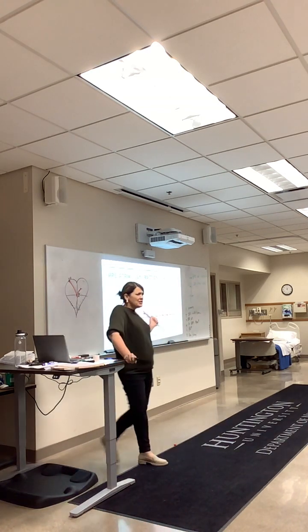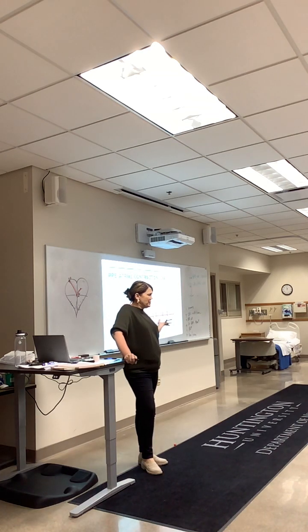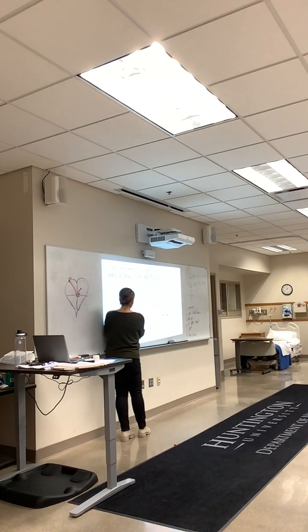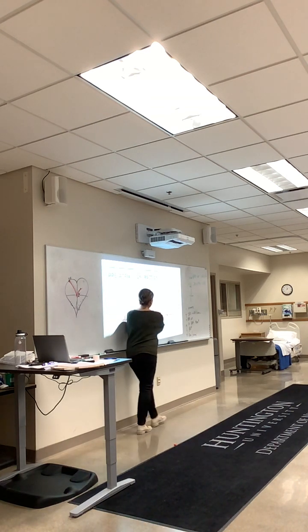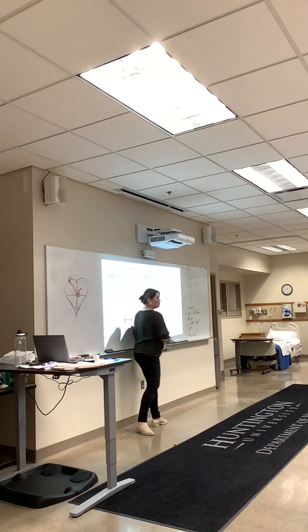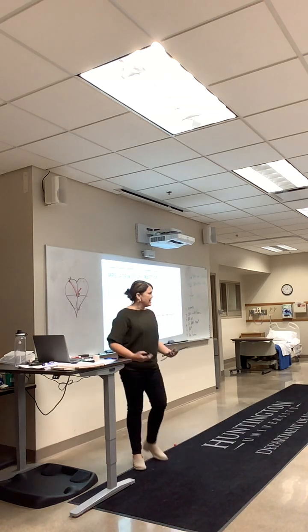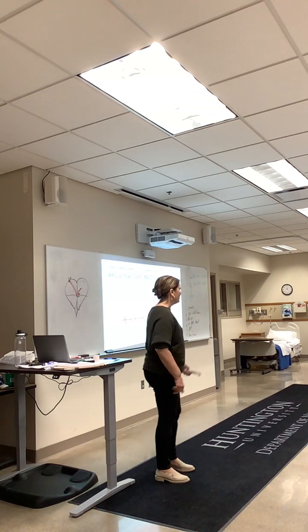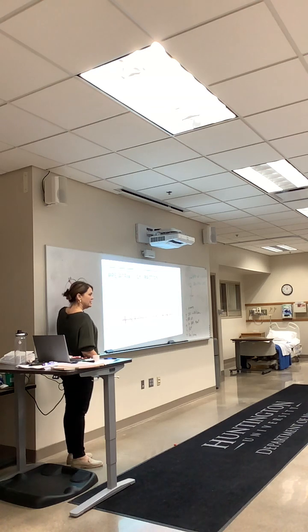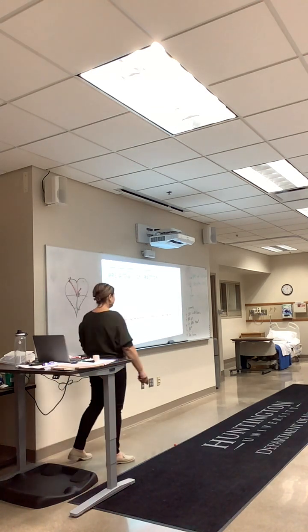So this gets a little harder to start reading. All right, so people look at this and wonder, what's going on? But if you just look, what's your underlying rhythm? That's when you grab your calipers, or look on your computer, and it will say whether it's regular or not. This one's pretty easy. Like right in here, it should have been right there, but this one just came early. So all it is is extra beats that came early. It's before it should have come. And it came from another location. Because if it came from here, it would have been firing the same way.